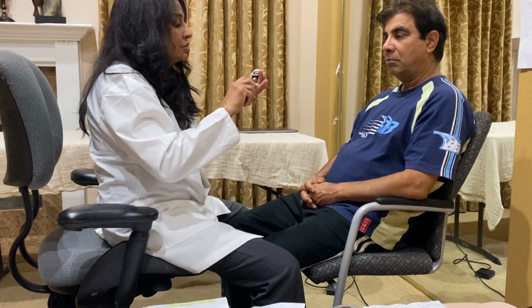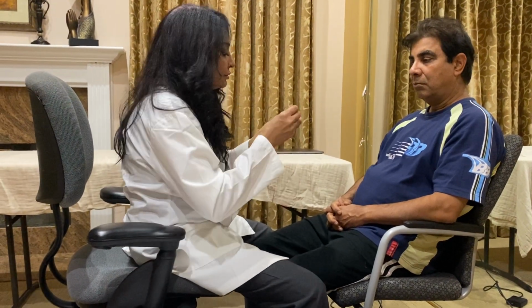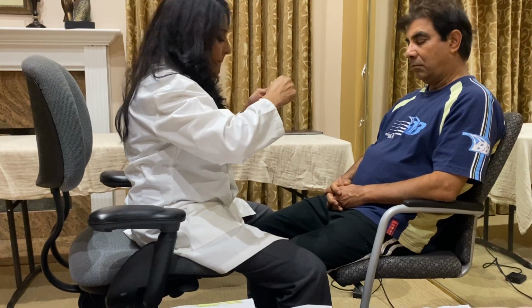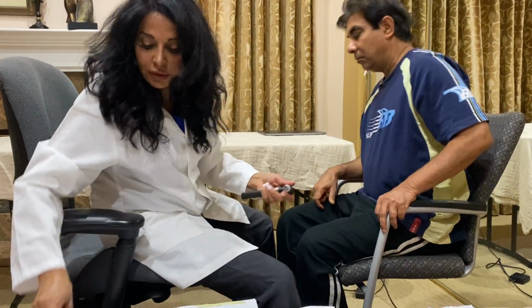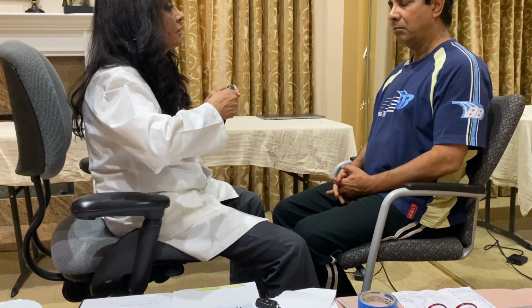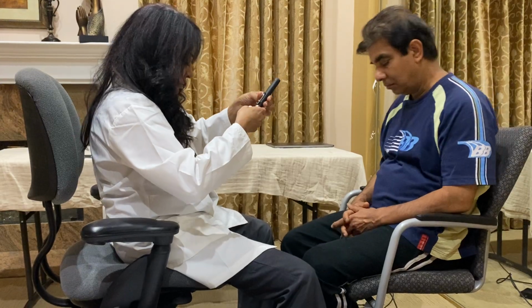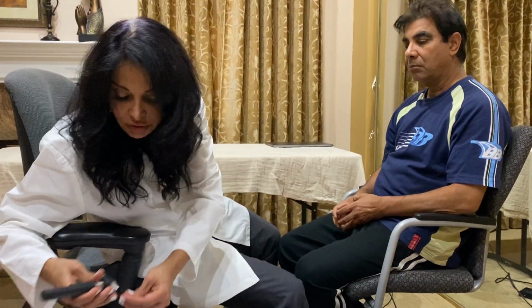And I'm going to attach this right here. Okay, I've got a new one here. Well, it keeps falling, but I have a new one.